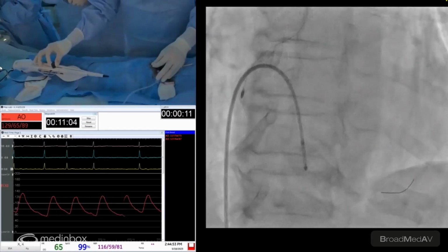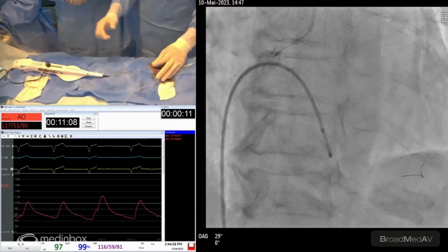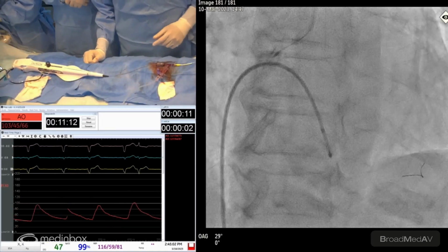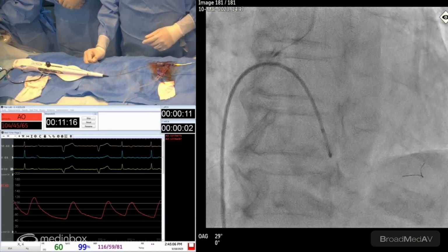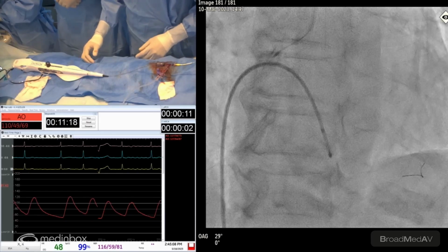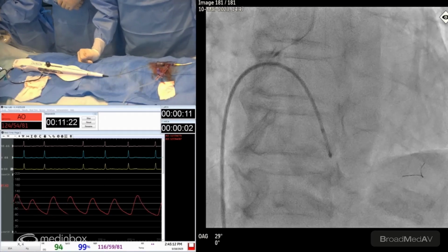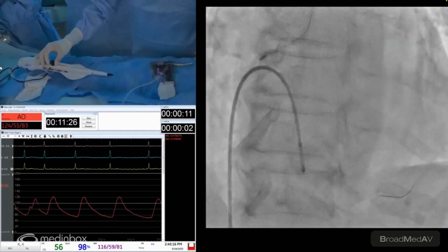There's a lot of resistance. I don't know if you can hear it. Oh, there you go. Let's save that. There was a jump. You saw the jump? Yeah, there was a jump, and the high pitch dropped suddenly. So that means that you crossed the lesion. How much decelerations did we have? So down to 170. Down to 165.